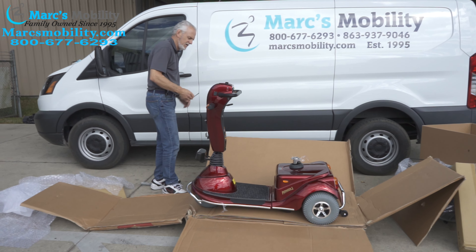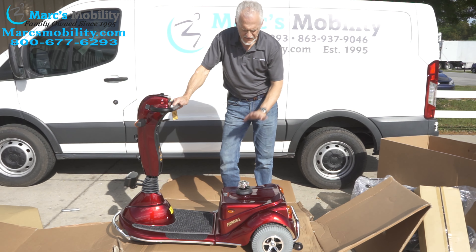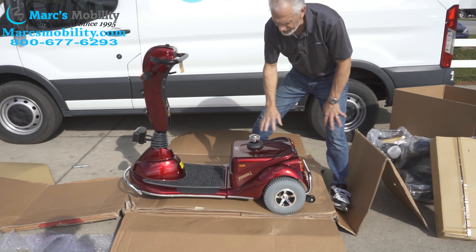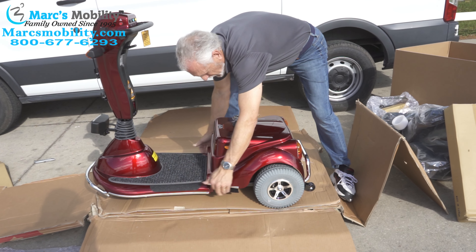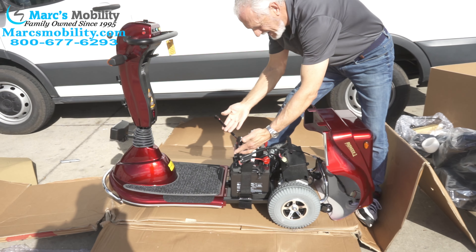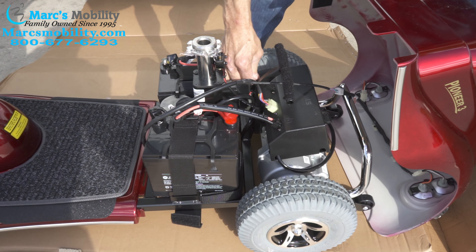I'm going to put the keys in the ignition — the ignition is on this side, right here. Turn the power on. If the power is not on with the key, that means you have to connect your batteries. This is why you don't want to put the seat on until you've got the key in. If there's no power, take your cover off — it's got really good Velcro. Pull the sides here in front, both sides, then pull it over the loop of the pole. Now if you look at your batteries, you can see they're not connected — you can see the two plugs. One plug goes right here, and the other plug goes on the opposite side. And now we have power.